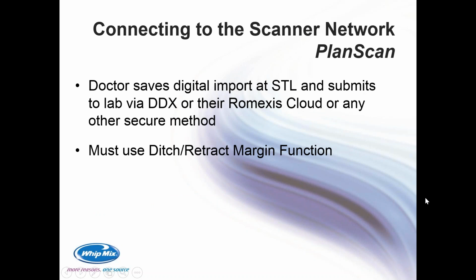Connecting to the scanner network through PlanScan, doctors save the digital import as an STL and then submit it to the lab via DDX or their Romexis cloud, or with it exporting as an STL, really any secure method. The one important note that I would probably want to share with you on the PlanScan, when they are saving that STL file to export it, you must use the ditch retract margin function.